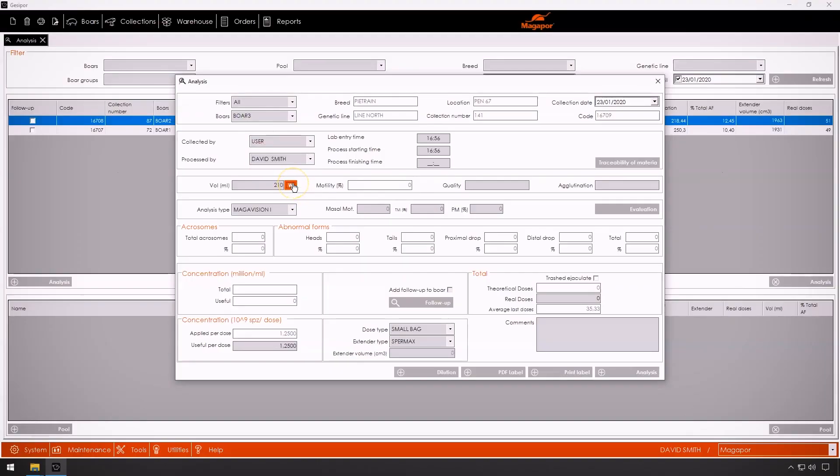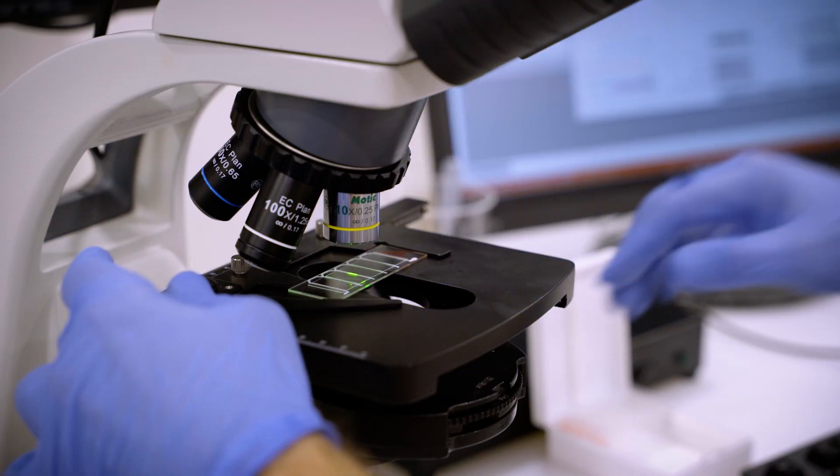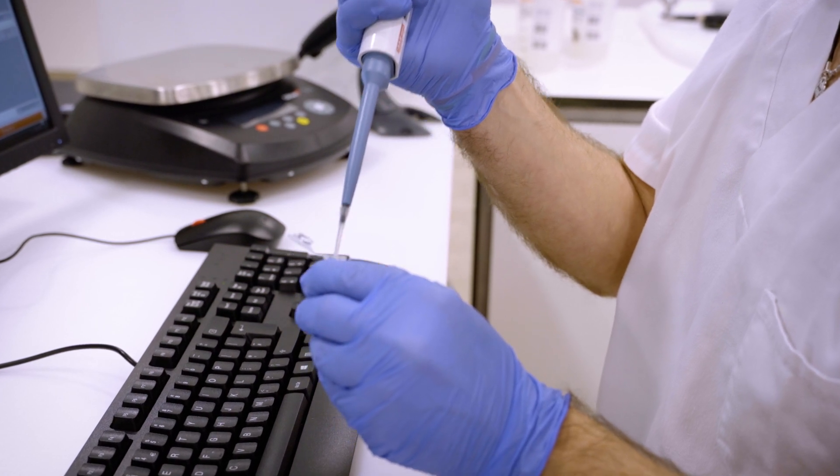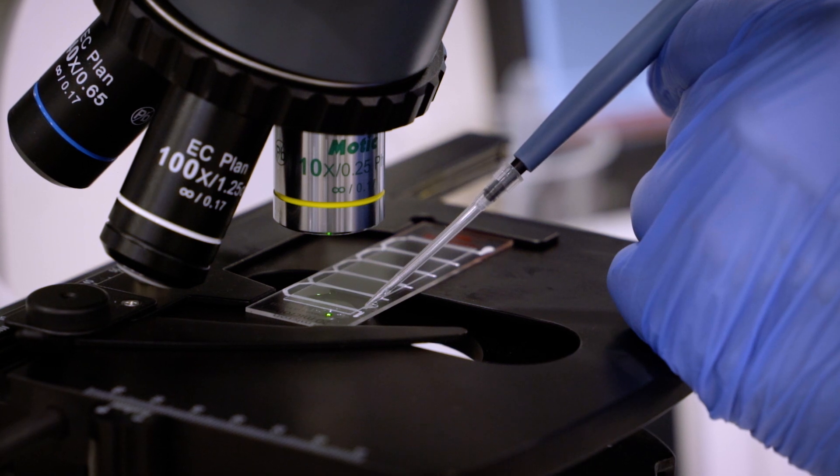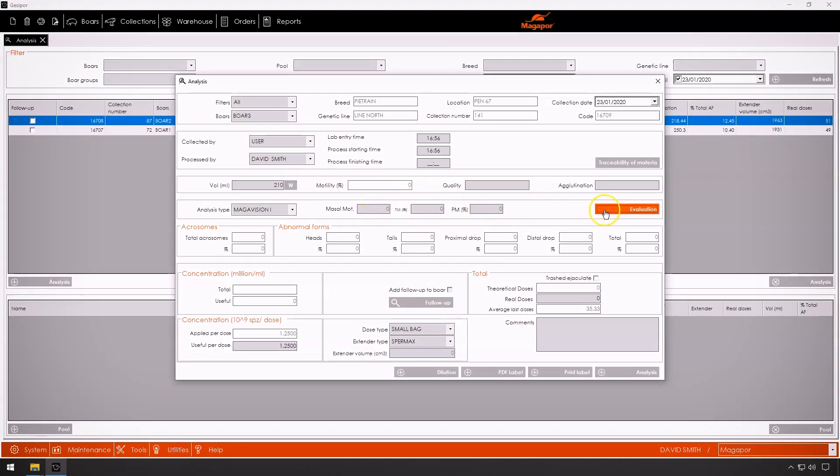Through a scale connected to the software, we automatically enter the volume of the ejaculate. After loading the sample and using a simple and intuitive interface, Magavision allows the user to carry out the analysis of the quality of that ejaculate in just a minute and a half.